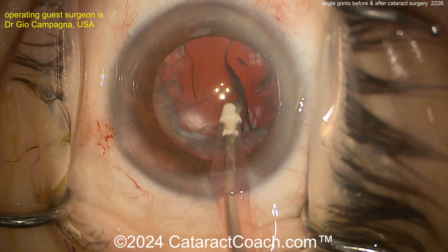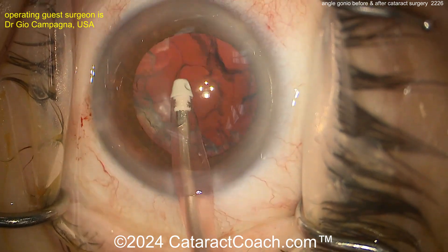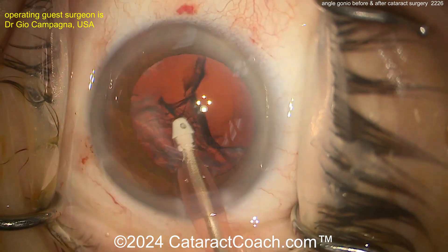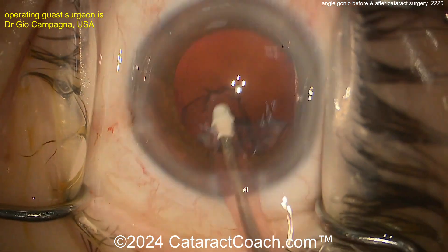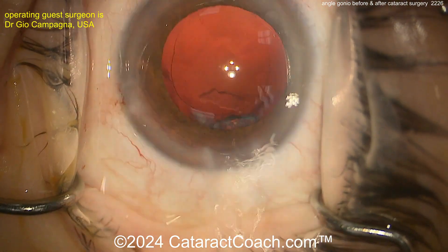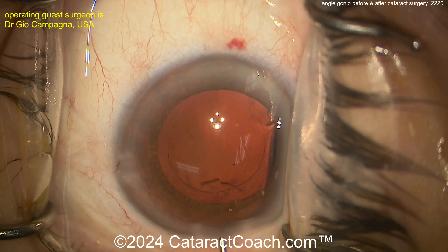Remember our podcast — Johnny Gaten's episode was fantastic. I think cataract surgery is now the treatment of choice. A patient coming into your clinic in their late 60s or early 70s — as they get older, the angle becomes shallower because they get more cataract development. As the cataract develops, the AC becomes more shallow because the cataract thickness anterior to posterior increases. By doing cataract surgery and putting in a thin IOL, we can absolutely restore the angle anatomy. We're going to see this at the end of the case — even right on the OR table, you'll see immediate restoration of appropriate angle anatomy. Once the eye heals and you get capsular bag contraction, it'll be an even nicer result.